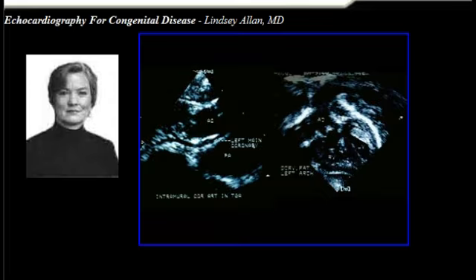Our surgeon always grunts at us when we bother doing this and says it doesn't make any difference to him where the coronary arteries are, but we still like to look. And in this neonate here, what we're seeing is that there's an intramural coronary. Not a common form of coronary artery anatomy, but one that occurs in about 1 or 2% of cases, where the intramural coronary lies between the two great arteries and runs in the wall of the aorta.